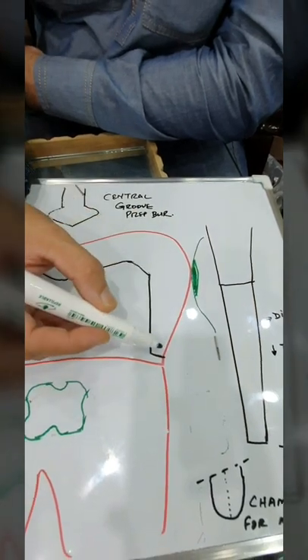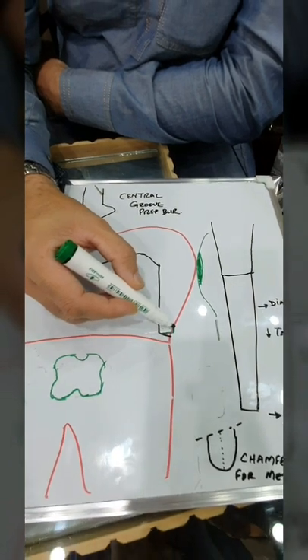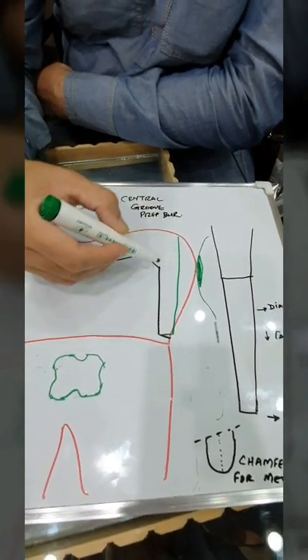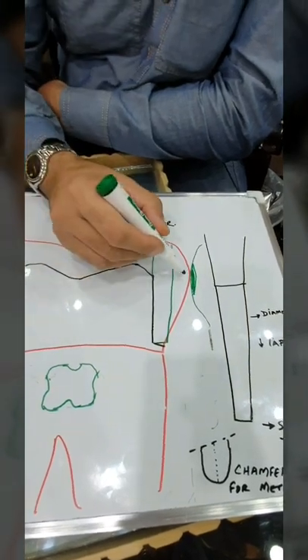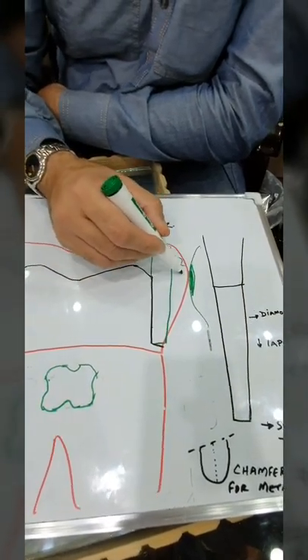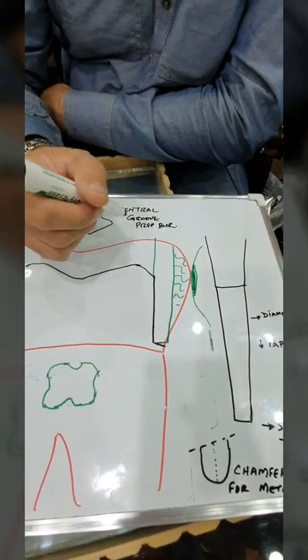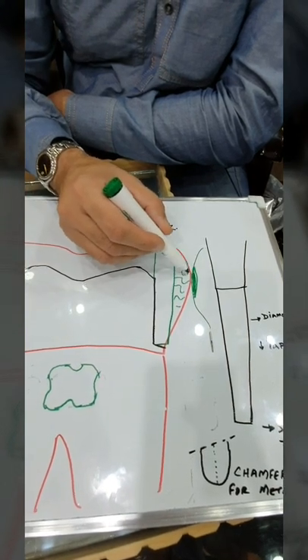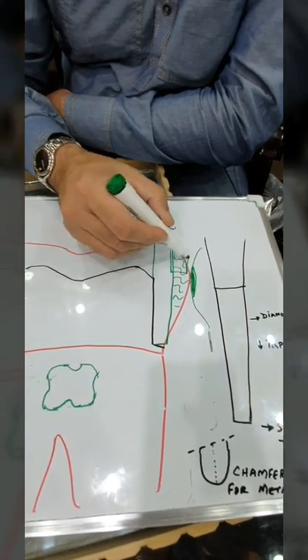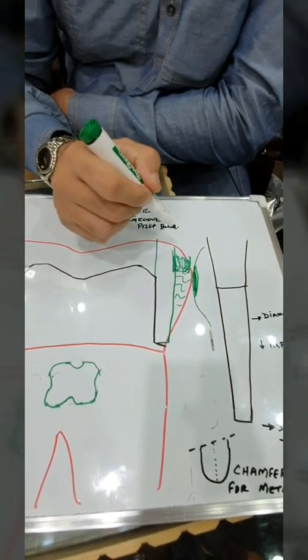What people don't realize is when you do put the diamond burr inside, this is the width of the diamond burr. And if you're cutting interproximally, even at a slight angle, you should have a sliver of enamel still left between the tooth you're cutting and the adjacent tooth. The mistake happens when people start cutting right here and they think that's where the margin is going to be. And as they're cutting here, they end up nicking the adjacent tooth.